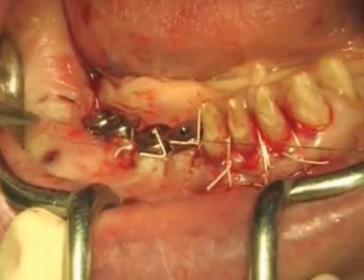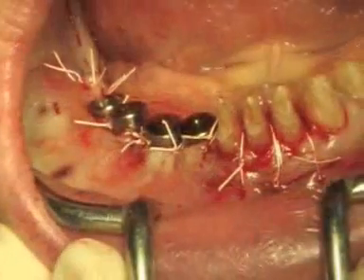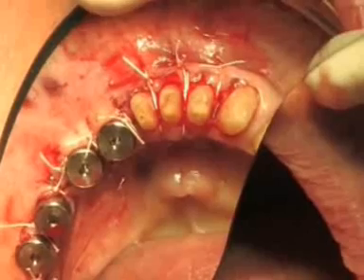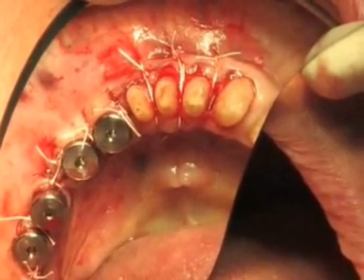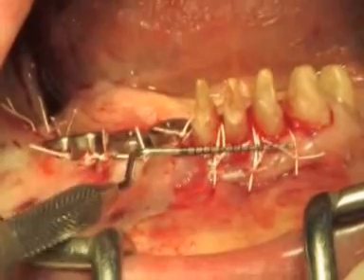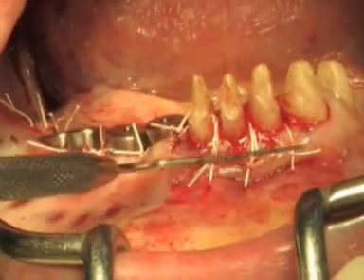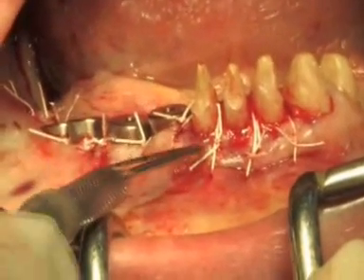Once the suture is finished, it is advisable to position a surgical dressing over the wound on the natural teeth for protection, because the flap has been positioned apically to the bone ridge, whilst at the level of the implants there aren't any particular problems. The completed suture can be seen. Using a probe, it is possible to see the two different levels of the gingival margin, positioned coronally to the implants and apically to the natural teeth. There are certainly about 4 mm difference.